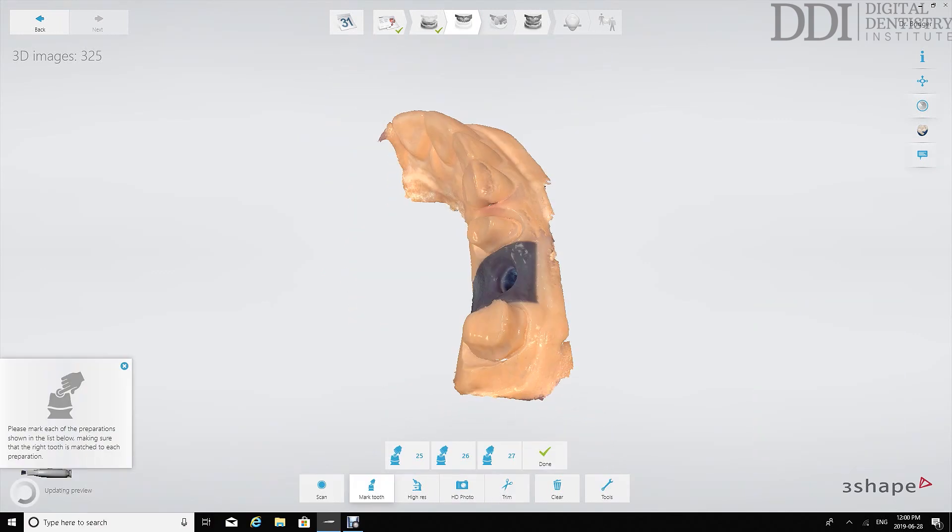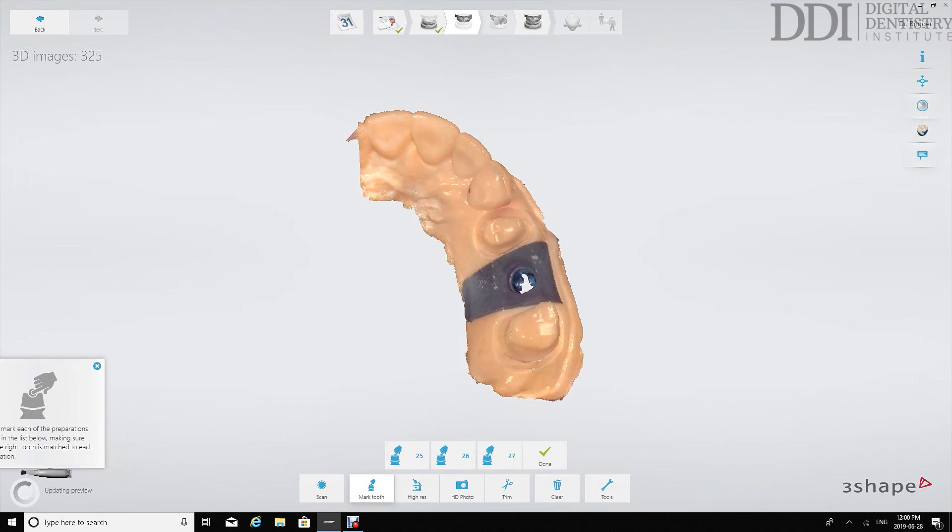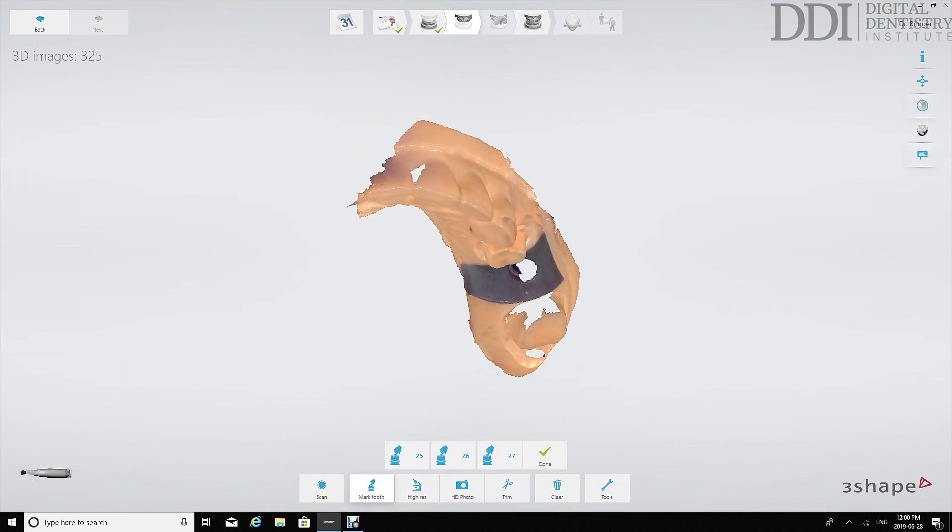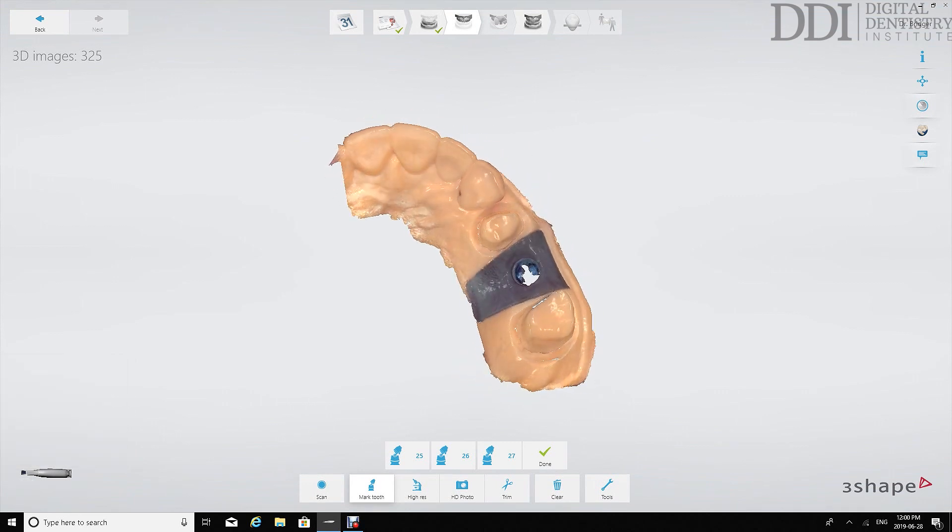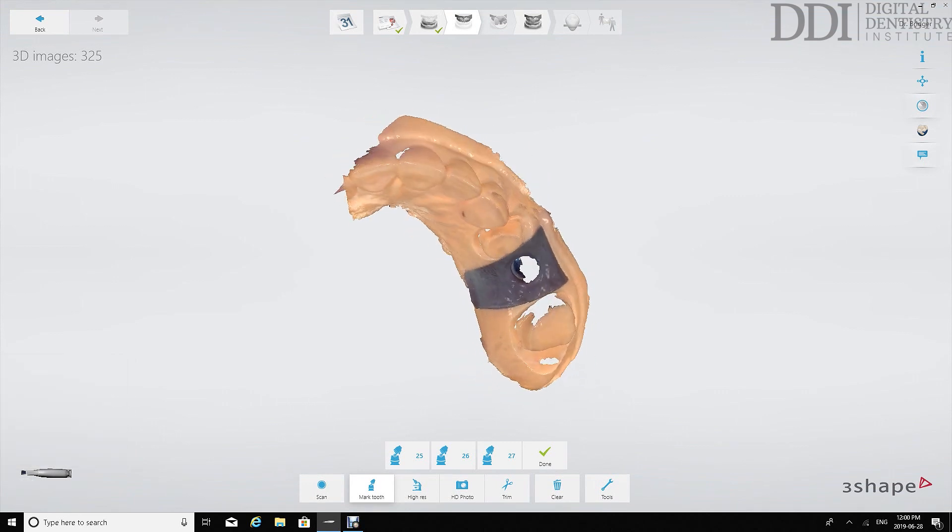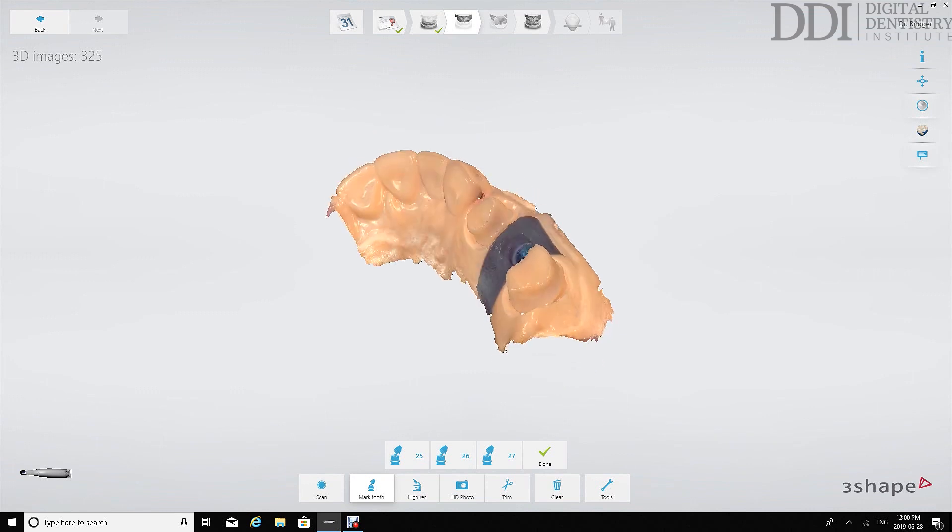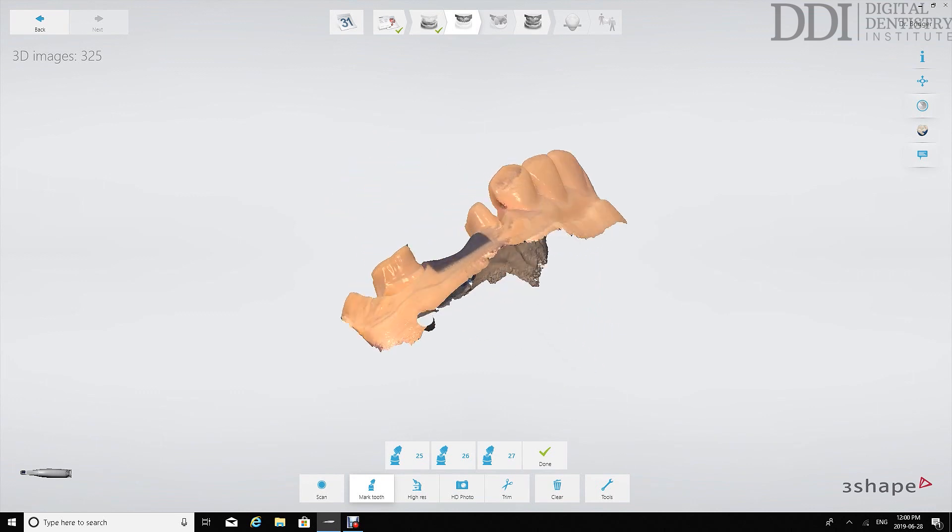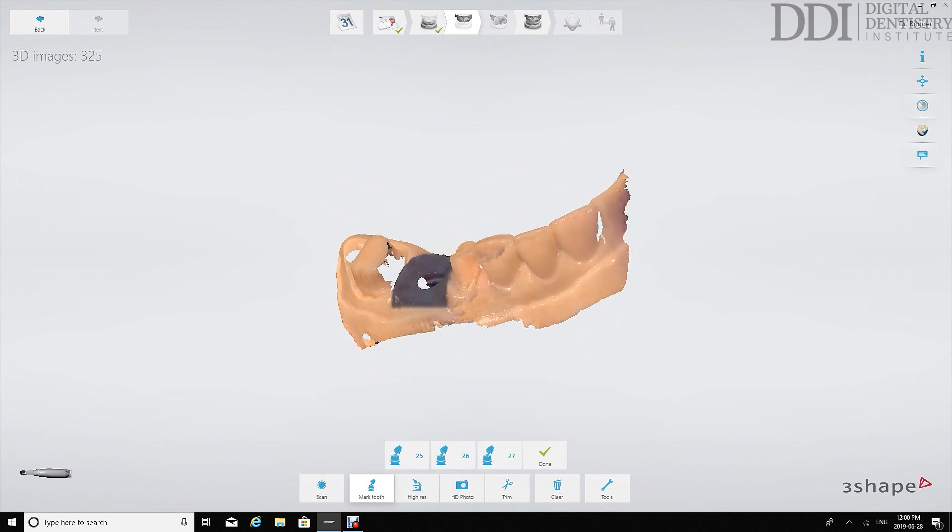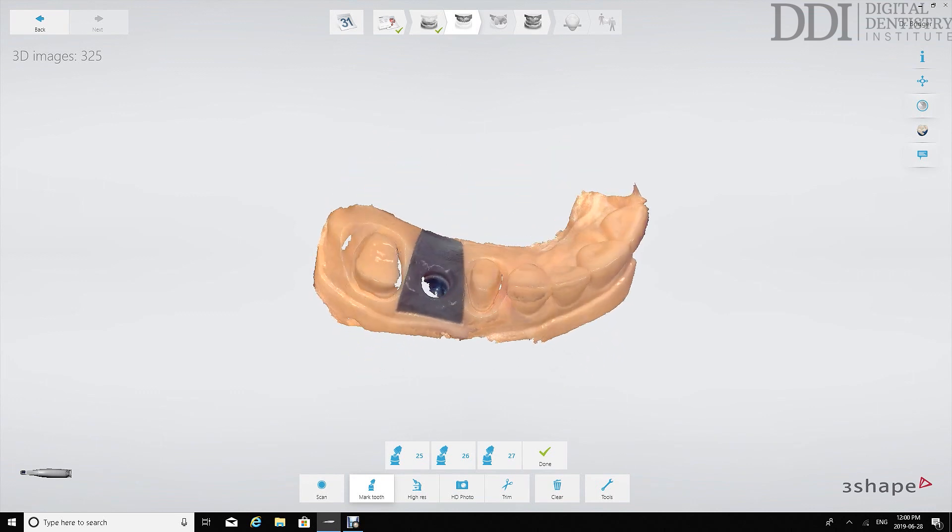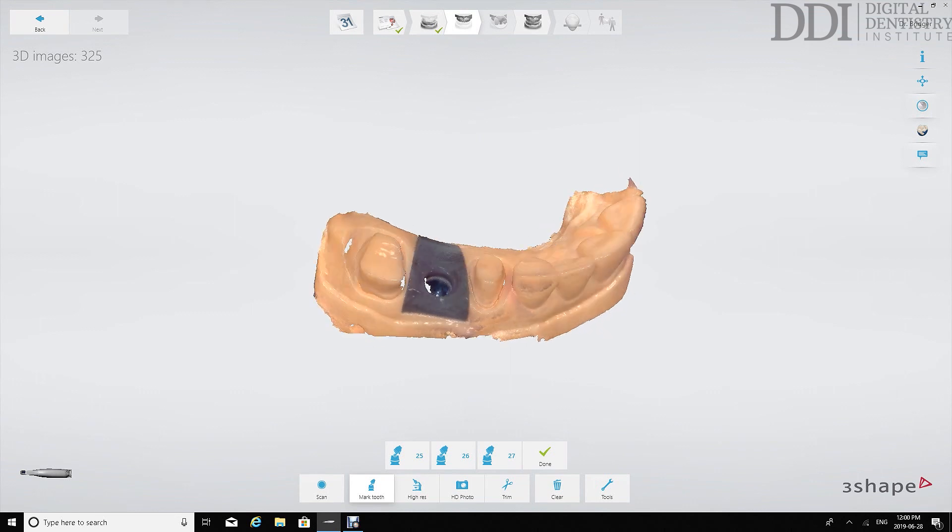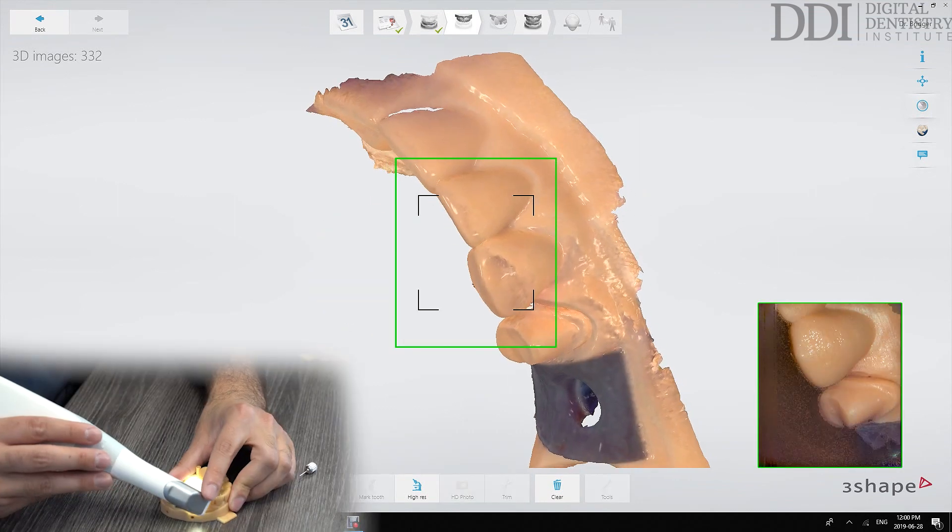At this stage when we review our impression we can see that there are certain areas that we have to go back in and scan. So we've captured the distal aspects nicely but we need to go back in and capture the mesios to get more information there.